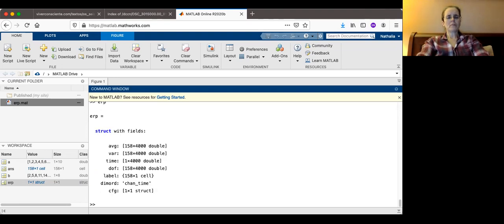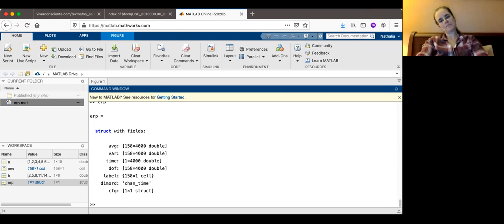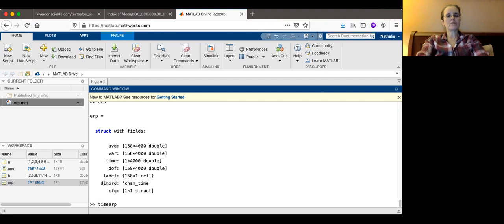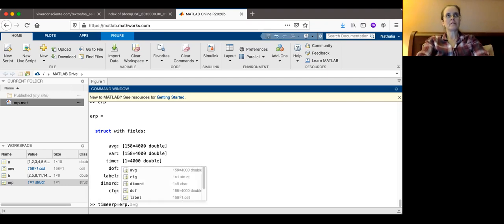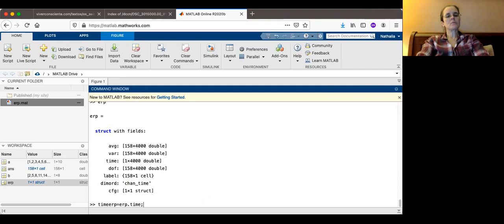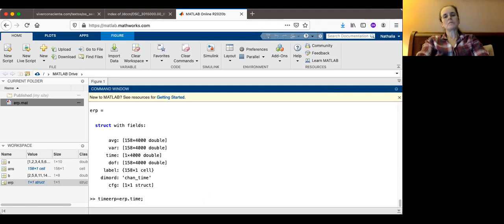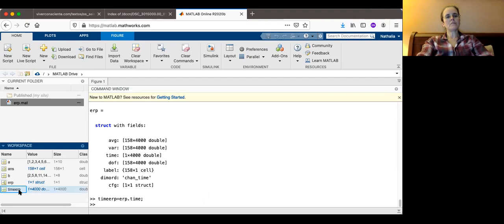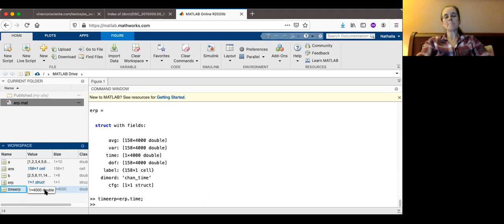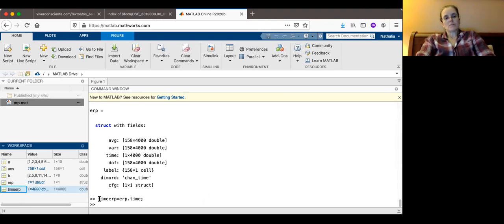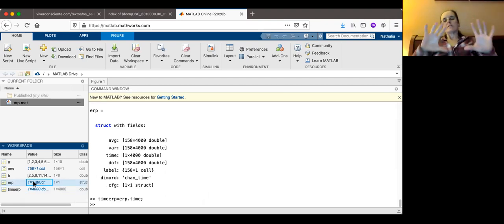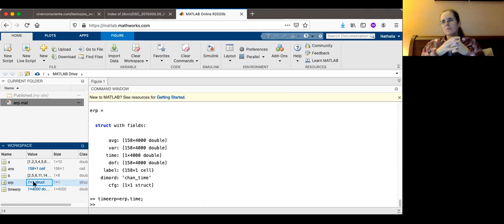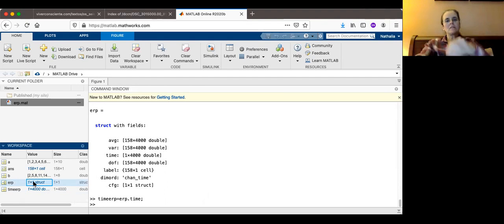I could say ERP, the label, and it's going to show me 158 of these labels for the electrodes. But back to the ERP, I'm going to extract time and the average. So I'm going to say time ERP is going to be the ERP dot time. Now I don't want to see all the numbers, so I put the semicolon at the end there. So you see there, on the left side, there is a new variable.